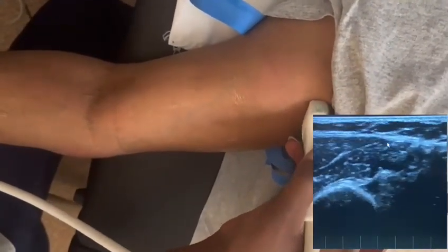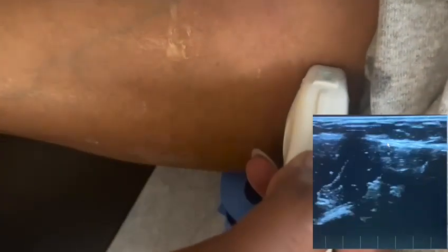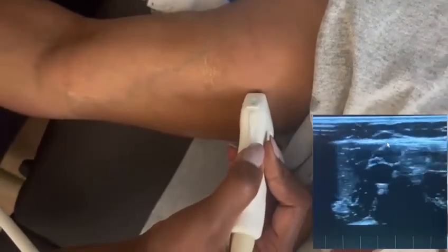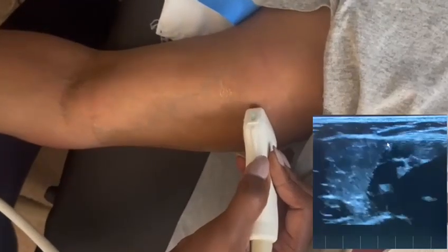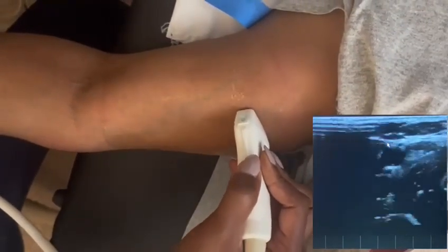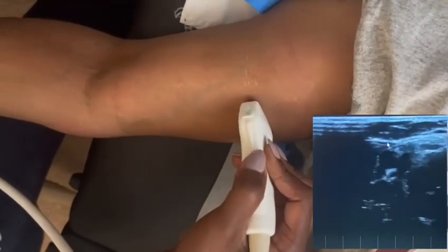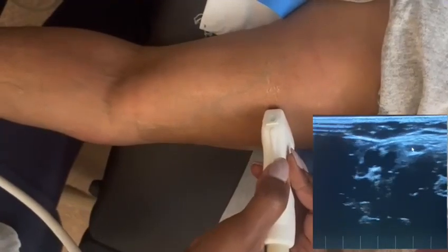In this view here, you can see I'm right around the axillary segment and I'm slowly coming down. Right at this segment here, you can see the brachial veins compressing very nicely and the artery as well. You can also see the basilic vein in this image at this point.